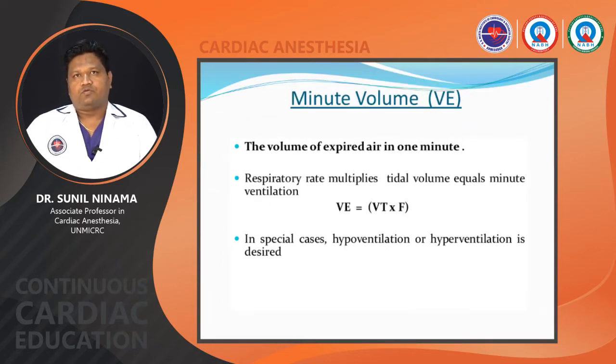Minute volume. What do you mean by minute volume? The volume of expired air in 1 minute is called minute volume. The respiratory rate times tidal volume is called minute volume or minute ventilation. In special cases, hypoventilation or hyperventilation is desired.